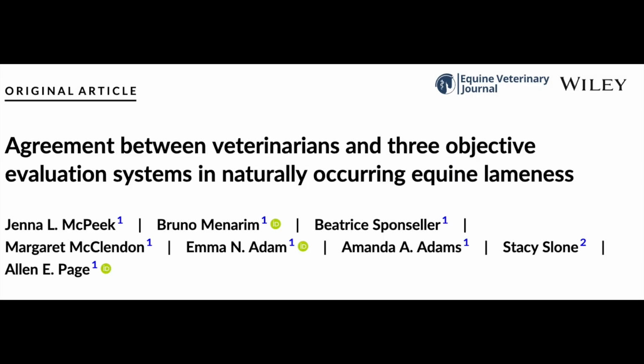A different 2025 study compared different IMU technologies, single camera systems, and subjective lameness evaluations, and found that agreement between all methods was high, although objective measurements were higher than subjective observation. Interestingly, the addition of the wither sensor on the Equisym system did not change the accuracy of lameness identification.